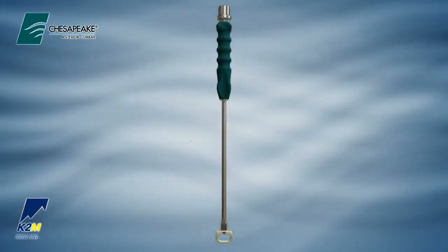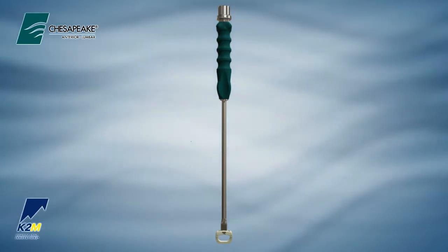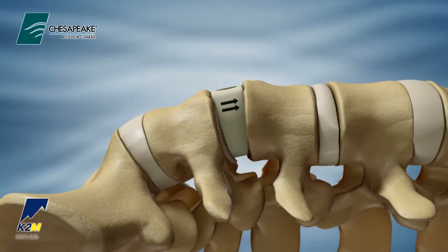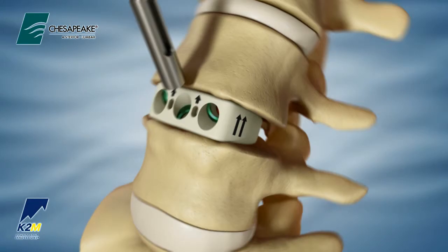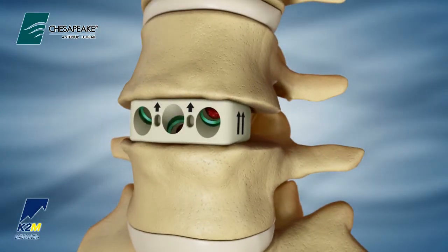Alternatively, if impaction is desired, the Chesapeake straight inserter may be used. Once the Chesapeake interbody is properly positioned, a spring-loaded punch may be used to aid in creating initial pilot holes.